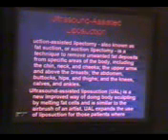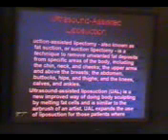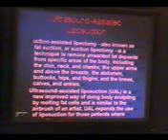Ultrasound assisted liposuction is a new improved way of doing body sculpting by melting fat cells and is similar to the airbrush of an artist. UAL expands the use of liposuction for those patients.